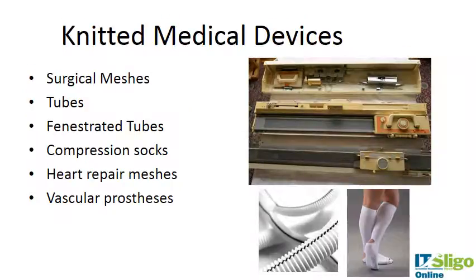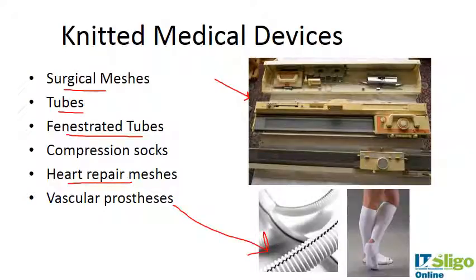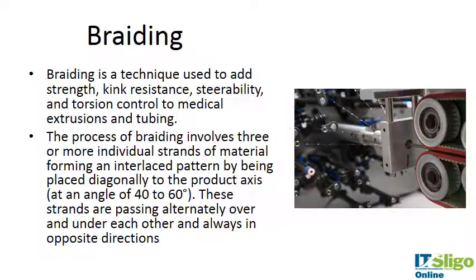This is a traditional knitting machine — I couldn't find one specific to medical devices. The types of medical devices that would be knitted include surgical meshes, tubes, fenestrated tubes for breathing, vascular grafts, vascular prostheses, heart repair meshes — where a mesh may be used to help repair damaged heart tissue — and things like compression socks.